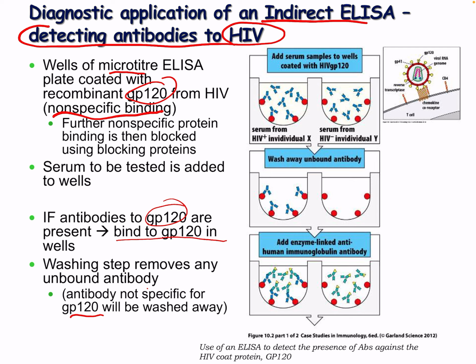This works a little differently from how I originally talked about it with IL-8. Instead of IL-8 already being in the blood, we're not testing the blood for antigen, we're testing for an antibody response. So now we have pre-coated antigens, and we want to see if our body has antibodies. You can see we add the enzyme-linked antibody, and then we have this double binding again.